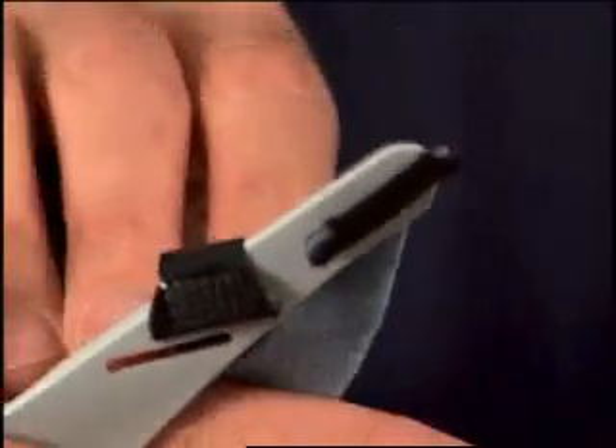To disconnect the chin support band or the headgear, peel the black tabs and slip the fabric pieces back through the slots.